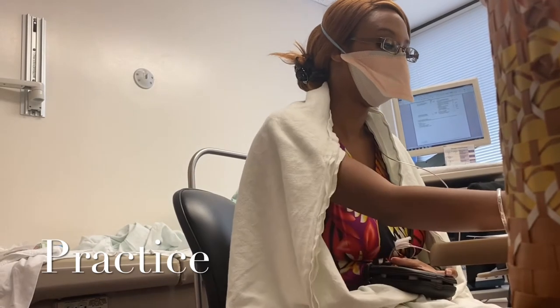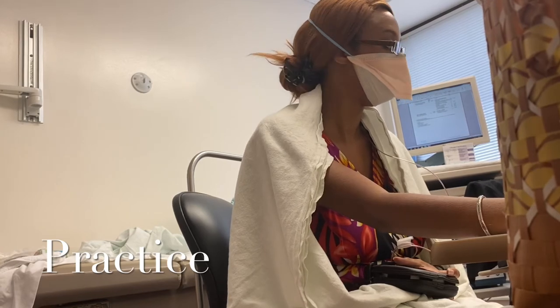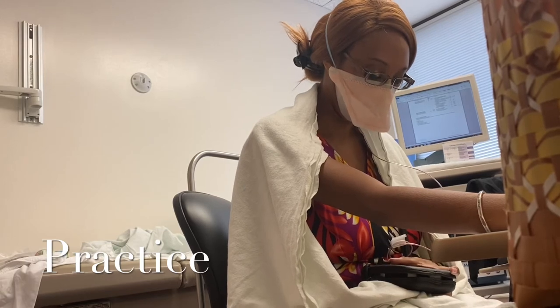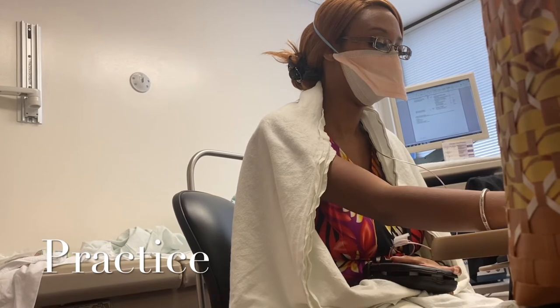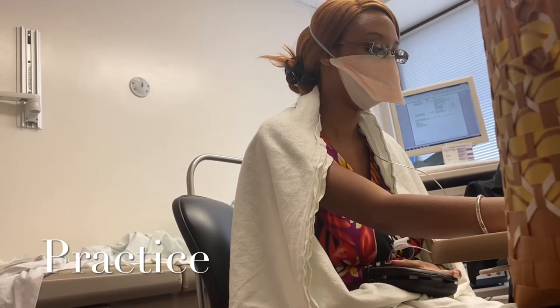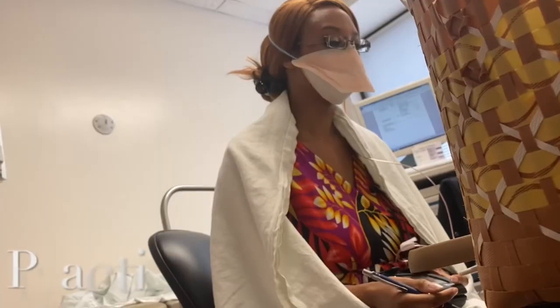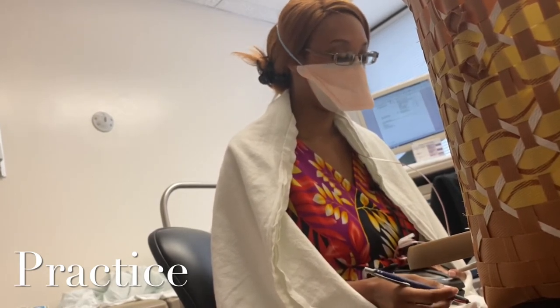No. All right. Now, number three, the other symptom you have is regurgitation. So when you feel something coming up, you're going to please push number three. So push number three. What time does it say? 14:26. So you put 14:26 and a check mark by regurgitation. And that's just when something comes up. Sometimes it'll just feel like it comes up and goes back down. Any questions on that? Okay. Any other questions? All right, these are our practice, but I want to do some practice that you're not going to write down. What are you going to do if you have chest pain? What number is that pushing for?